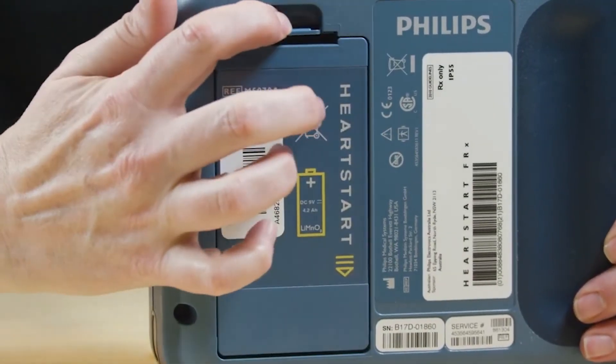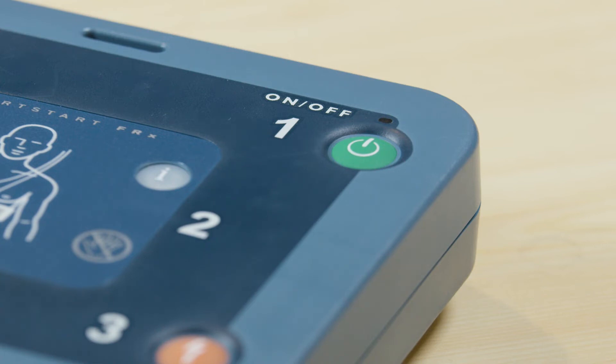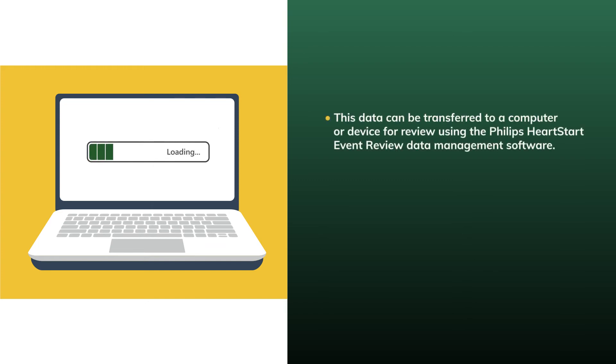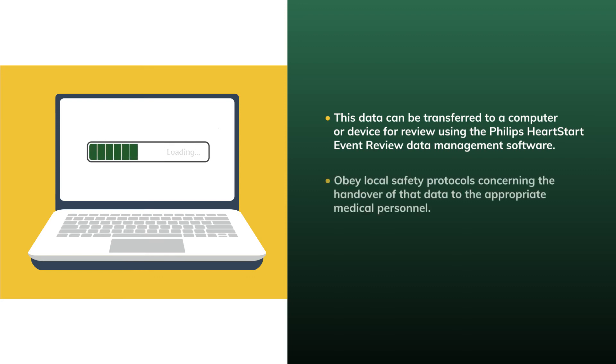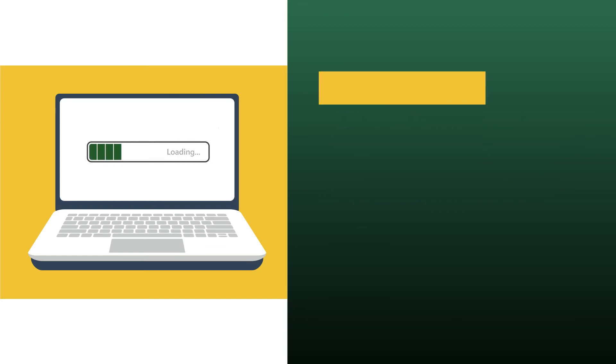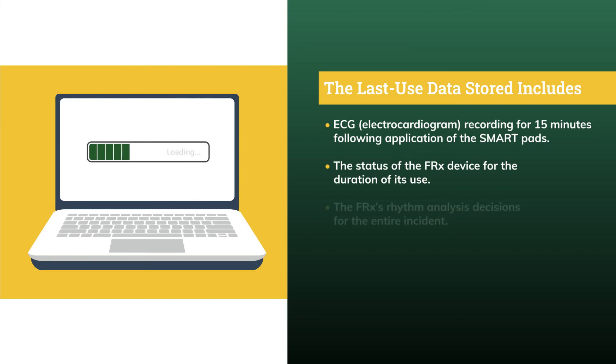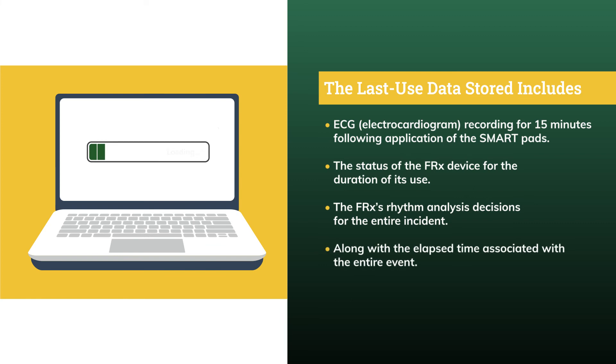Reinstalling the battery initiates the device's battery self-check and confirms its readiness. Check that the green ready light is blinking, then return the HeartStart FRX to its normal storage location. The HeartStart FRX AED stores data automatically for 30 days following its last use. This data can be transferred to a computer using the Philips HeartStart Event Review data management software. Obey local safety protocols concerning handover of that data to appropriate medical personnel. The last-use data includes an ECG recording for 15 minutes following application of the smart pads, the status of the FRX device for the duration of use, the FRX's rhythm analysis decisions, and the elapsed time associated with the entire event.